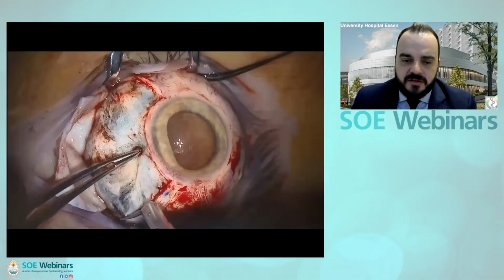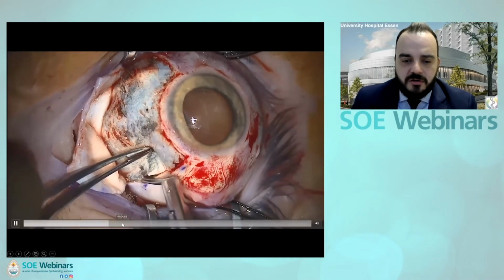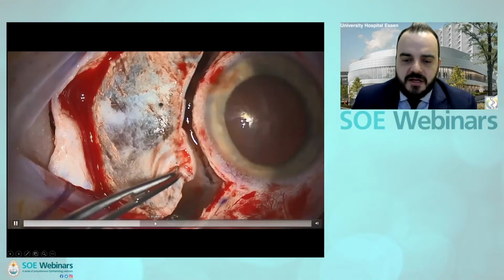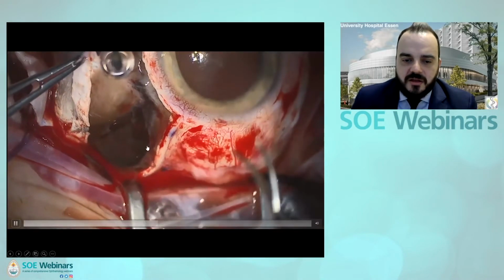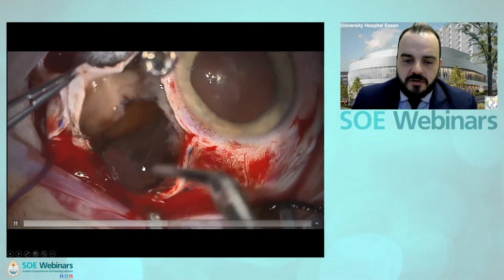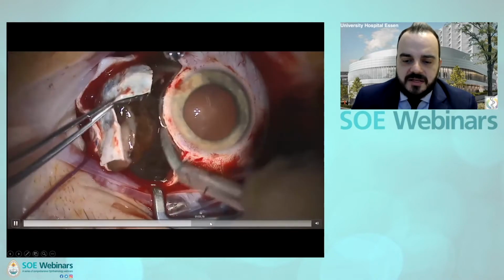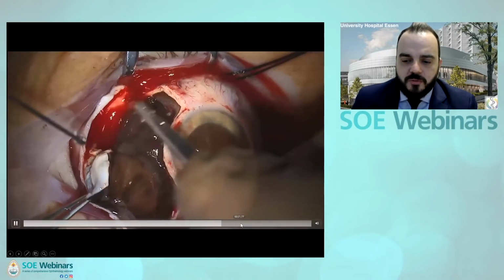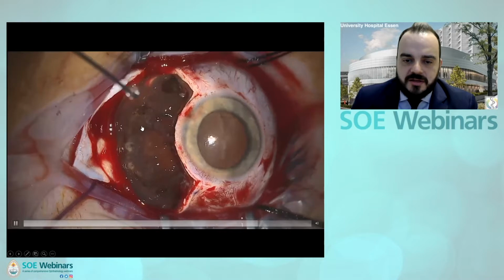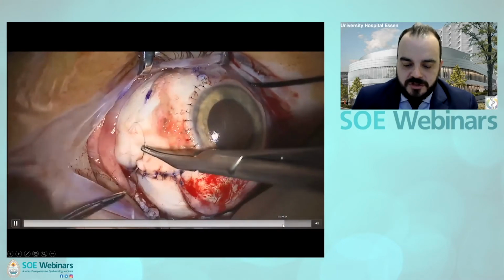In the posterior part, this is another vortex vein, and then we start cutting the tumor all the way around the inner flap of the tumor, and you can see we will go 360 and then start separating the normal choroid, the tumor here, from the retina. This is the retina, what you can see here, and of course we will go 360 and then separate the tumor, remove the tumor very carefully, and what you see here is the retina, and then we close the flap with many sutures.